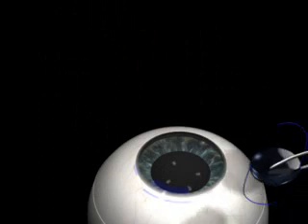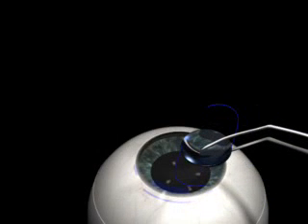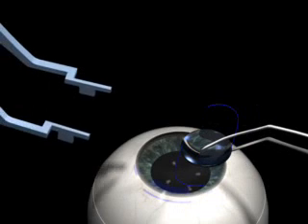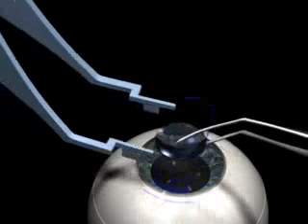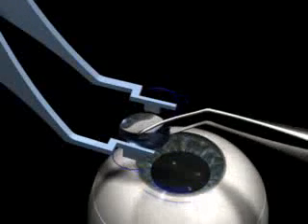IOL folding. The IOL is folded before implantation. This allows implantation through a small incision.